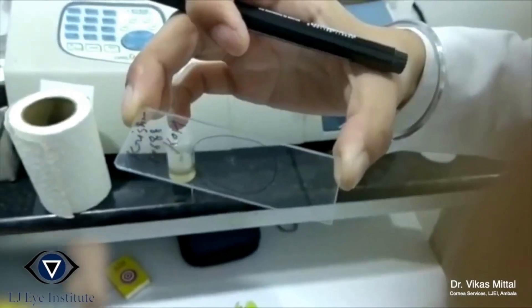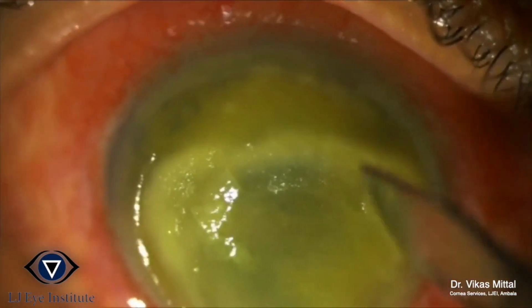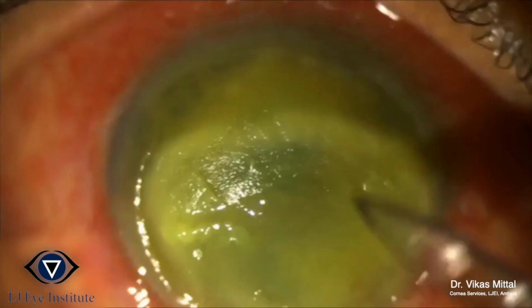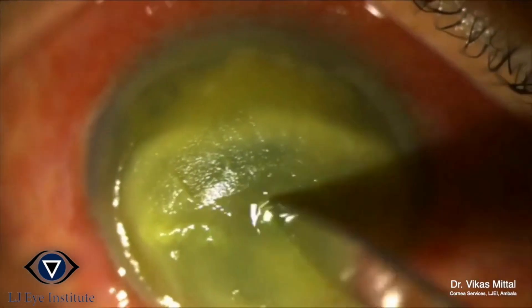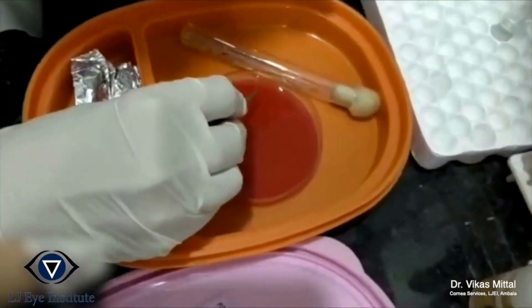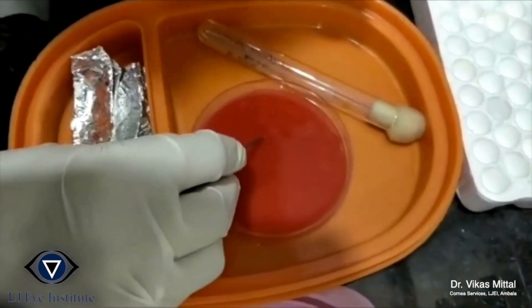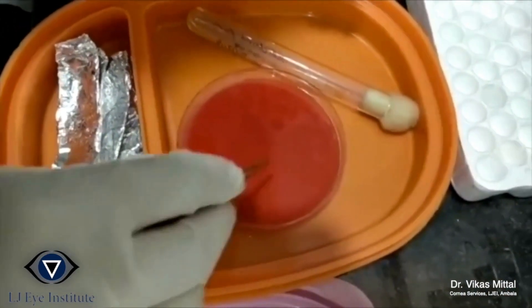After this, more material is obtained for inoculation on culture media. The material is inoculated on blood agar in the form of C shapes.